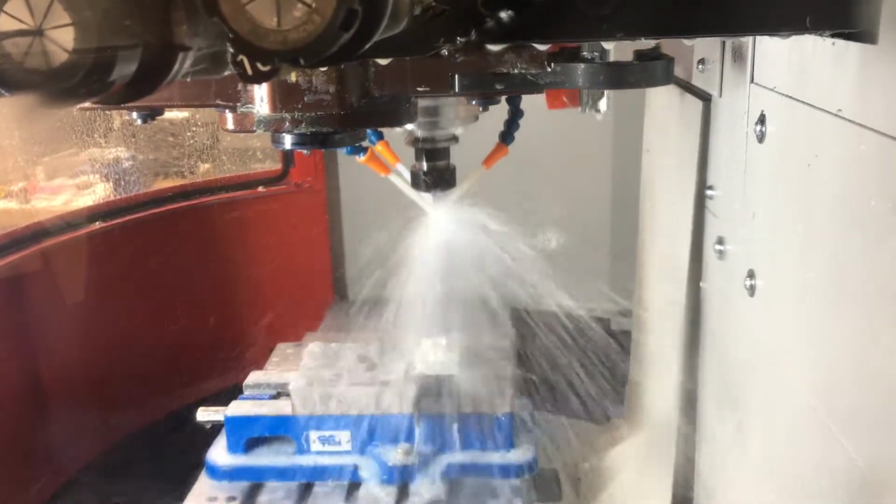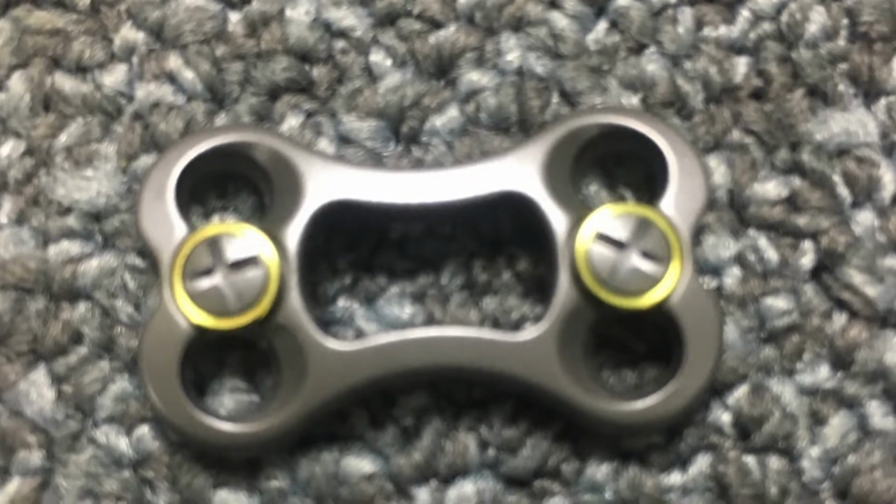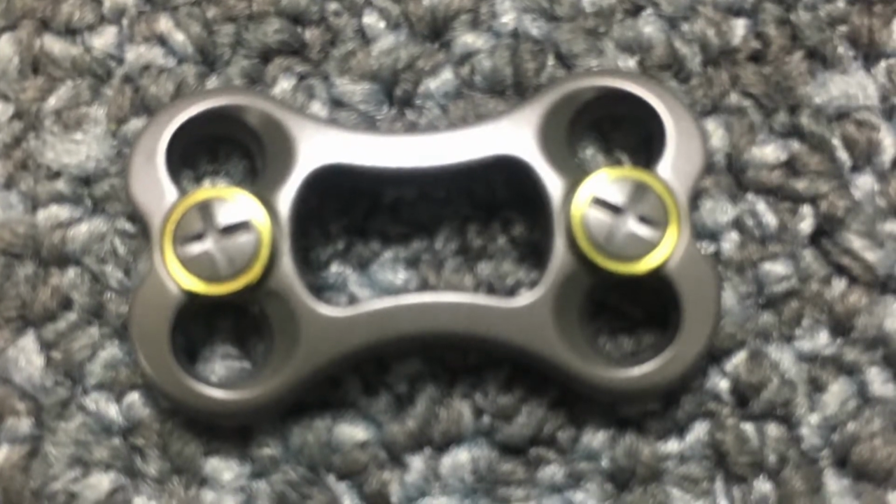Today we will be taking a look at the manufacturing of a cervical spine implant plate. Here is a photo of the original inspiration implant.